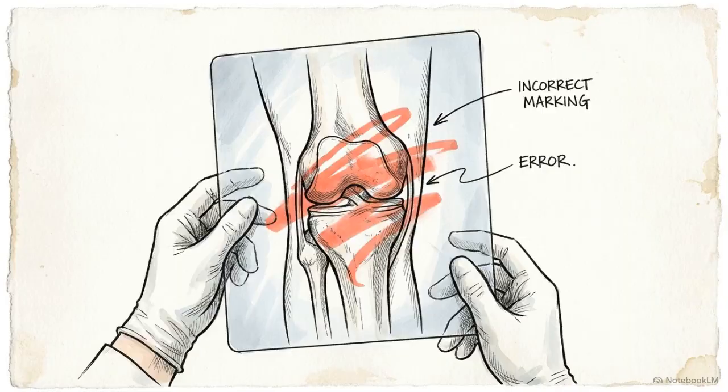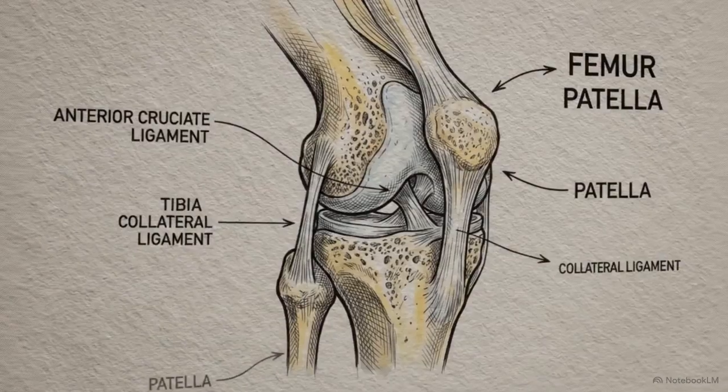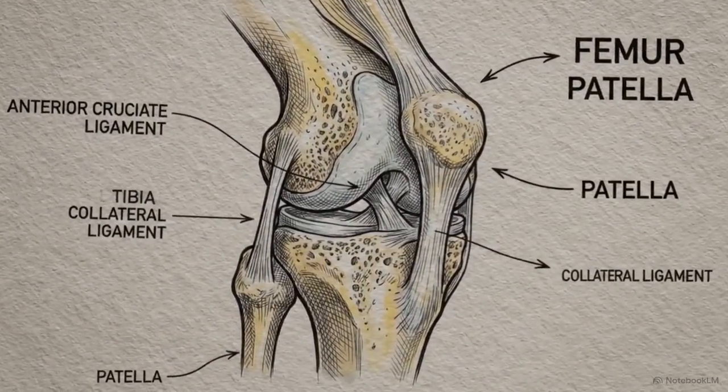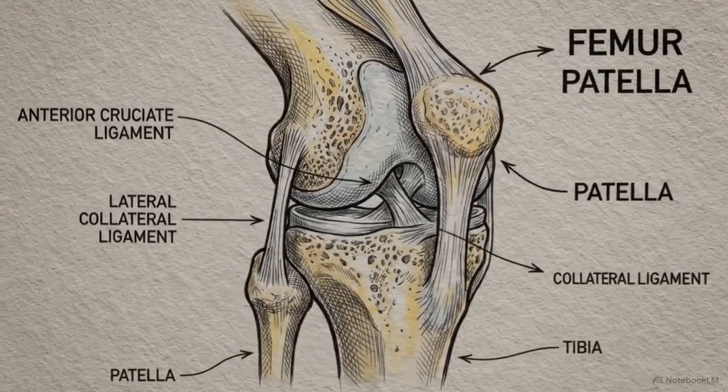When surgeons manually plot these lines on raw X-rays, human error in landmark placement introduces significant inter-observer variance. A comparative study analyzed the accuracy of semi-automated software planning against manual measurements across a cohort of varus knees. To verify the precision of the two-dimensional planning, researchers utilized three-dimensional computed tomography scans as the absolute geometric gold standard.